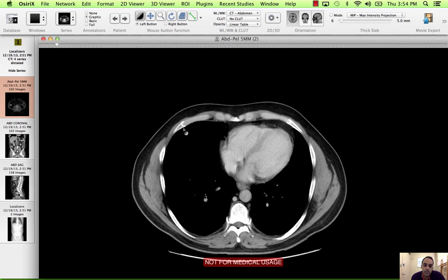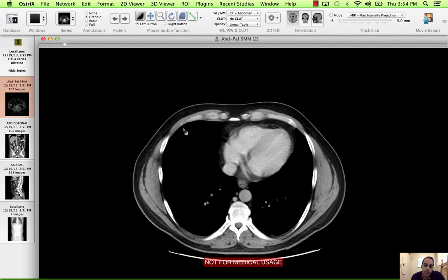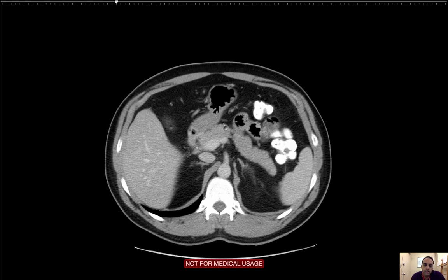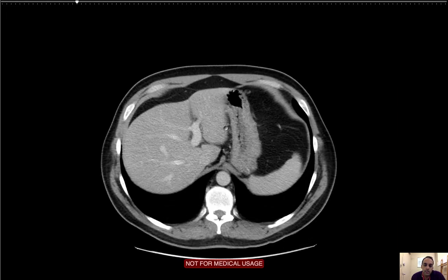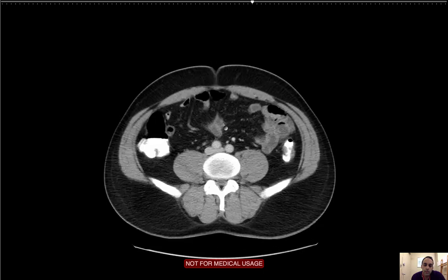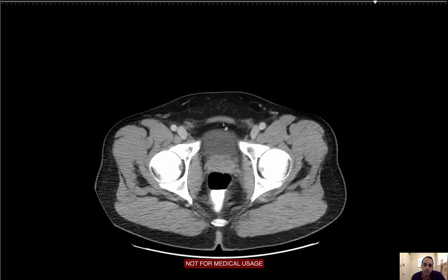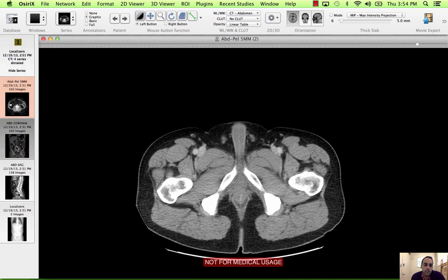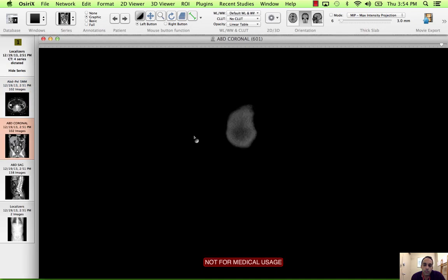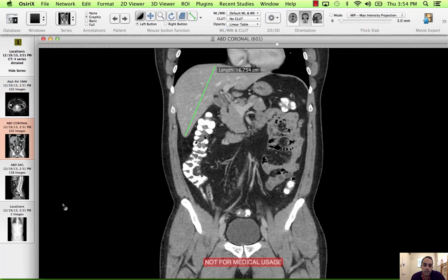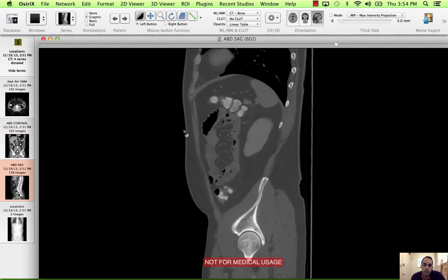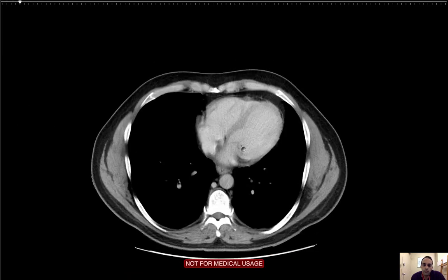First, I'm just going to say history, which is abdominal pain, then the technique. I can describe this as contiguous axial CT images of the abdomen pelvis from the lung bases to the pubic symphysis. I have coronal and sagittal reformats available for review. I'm going to go ahead and start with the axials, beginning with the lungs.